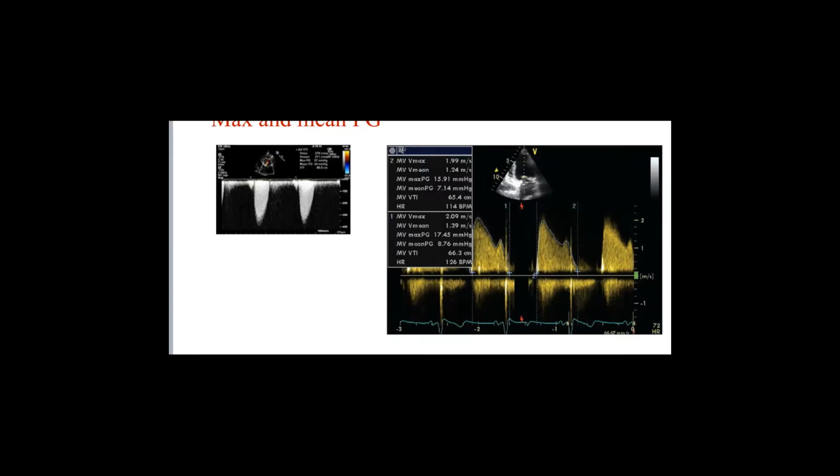That's why when we talk about aortic stenosis, we always consider the flow: low flow, high flow, normal flow. Even in MS, if you have tachycardia changing the flow, or bradycardia changing the flow, the gradient will change. The loading condition and the fluid status all change the flow and therefore will change the gradient. So the gradient changes a lot with the flow.